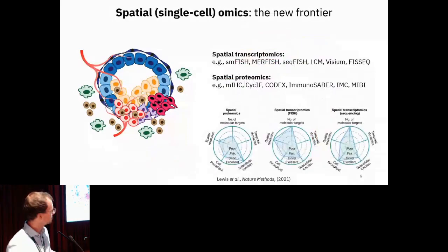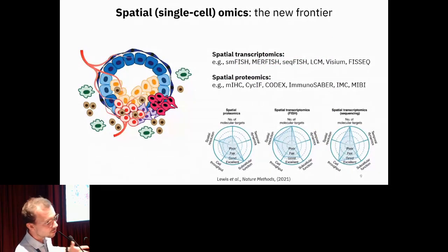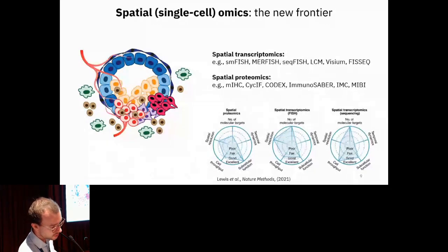Yes, but first, I would like to quickly talk again about the spatial omics technologies. Over the last few years, these spatial omics technologies enabled us to quantify proteins, so dozens of proteins, or even thousands of transcripts in tissue samples, while preserving their actual spatial location within the tissue. This is in contrast to the standard single-cell technologies, where you just have the abundances of the different cell types in the end.